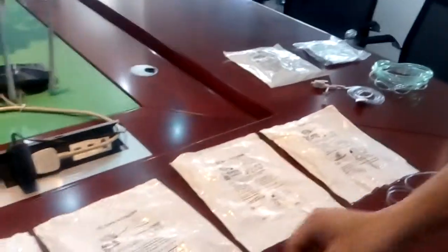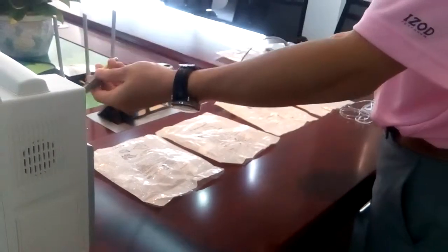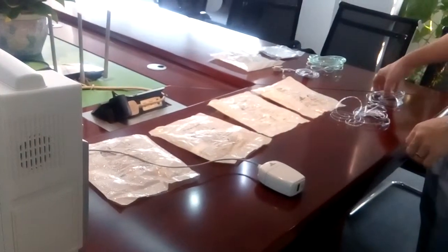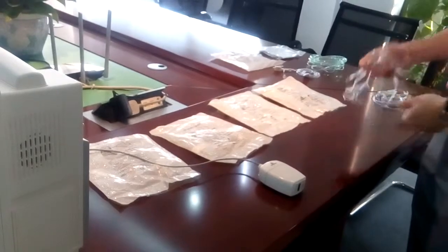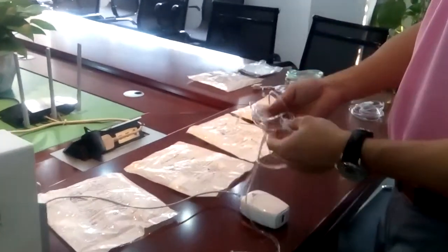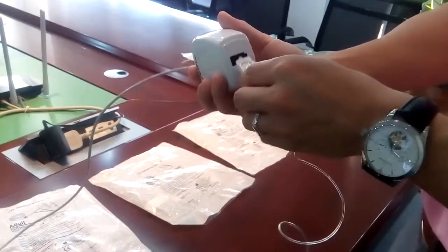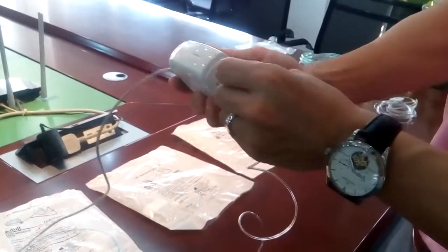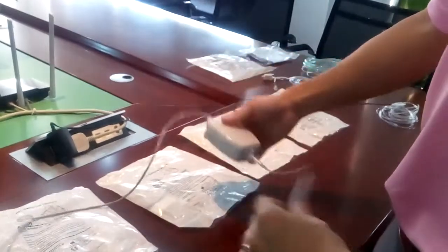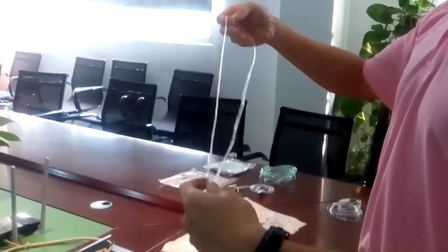How to connect? Because the connector cable is not long enough, I'm not going to connect the module to the patient monitor, but I will show you how to put the nasal cannula on the patient. We will choose this one. You can see these are the nasal ports. Here, you connect it to the sampling port — one click. If you want to take it out, just like this. Very simple. Then you put this side to the patient.